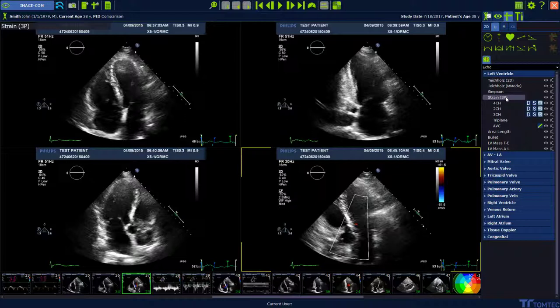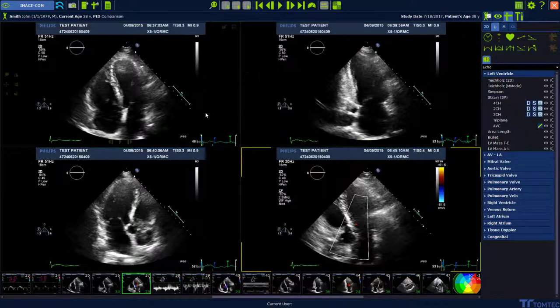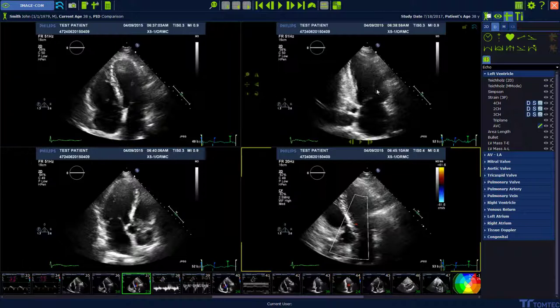Be careful because the software expects the images in the standard orientation. If needed, please use the flip and/or rotate button in the smart regions to adjust the image orientation.